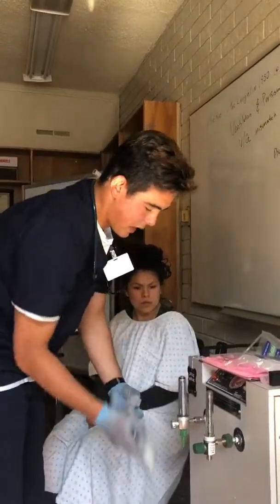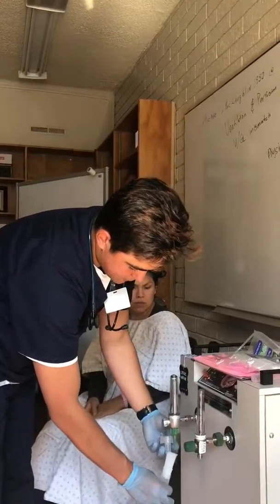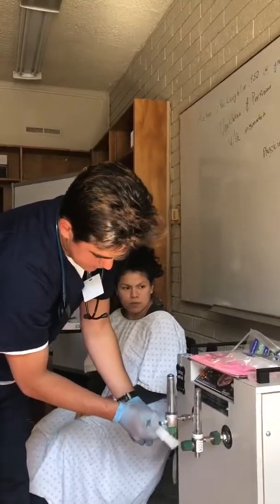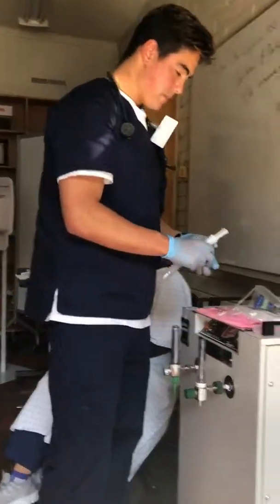Go ahead and dry all these parts with the oxygen. If it still needs further drying, we can go ahead and leave it to air dry.